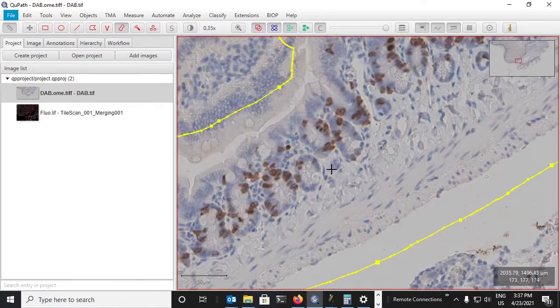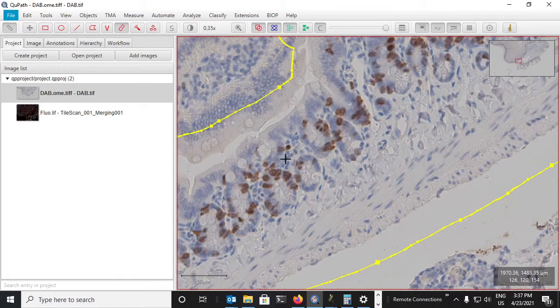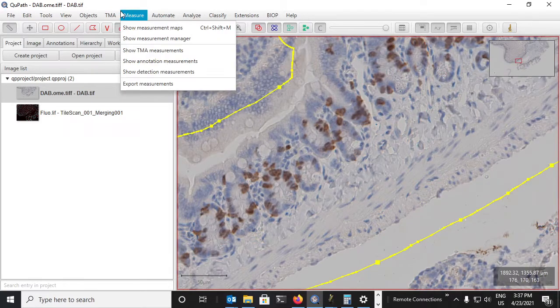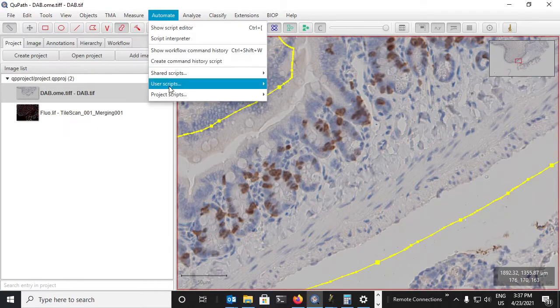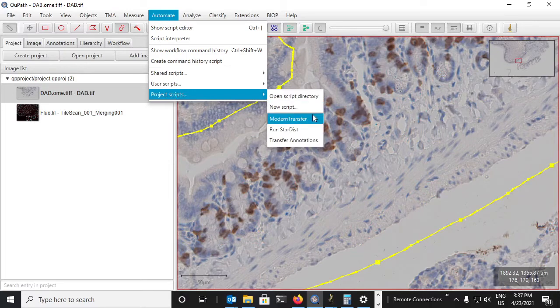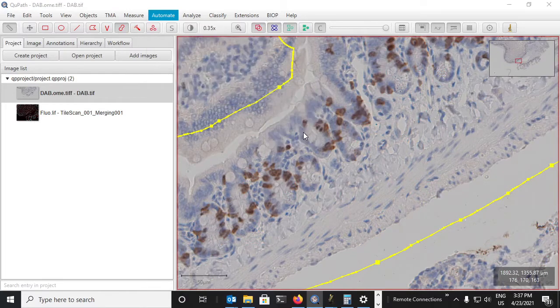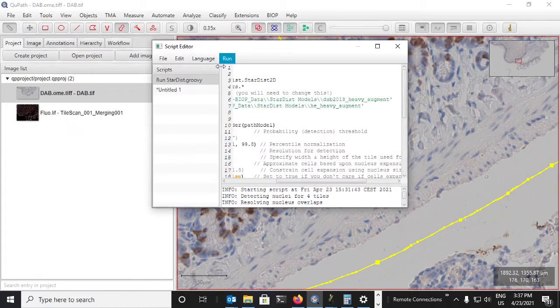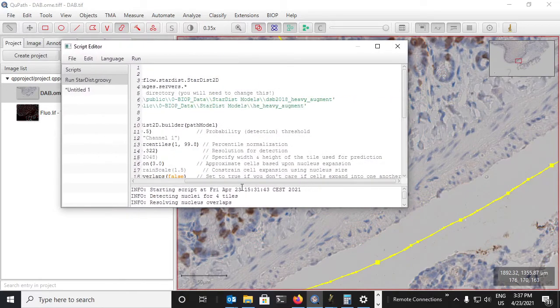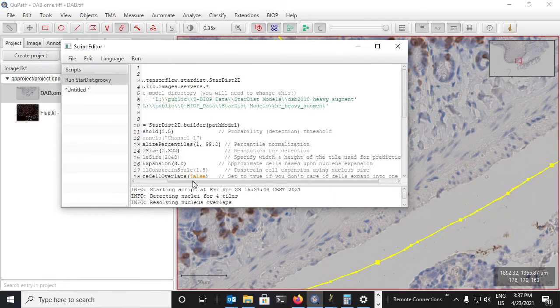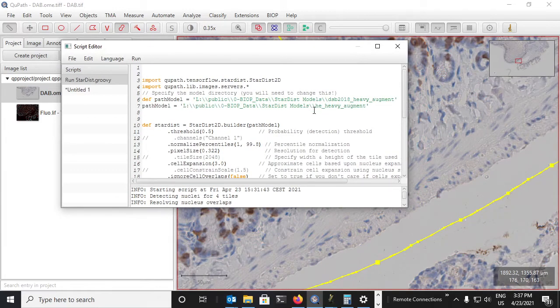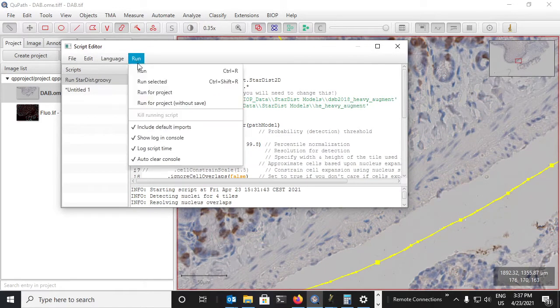So I have a script that allows me to run StarDist on the DAB image using the H&E heavy augment.